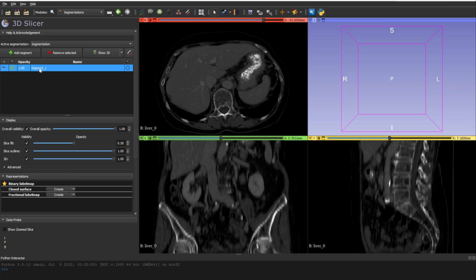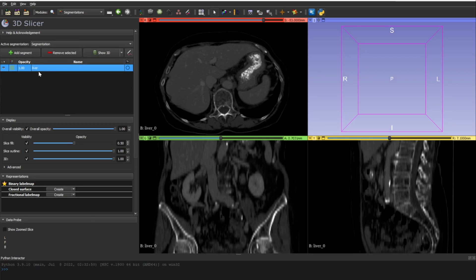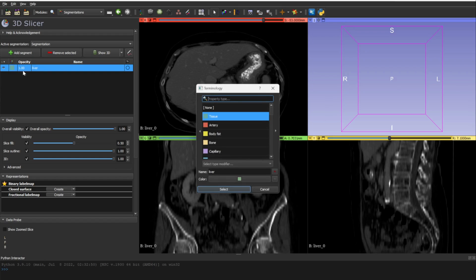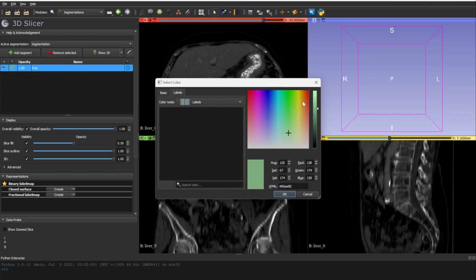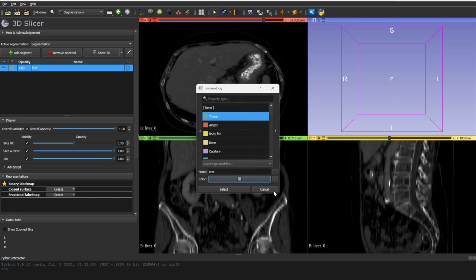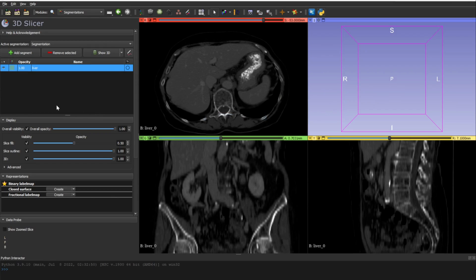Let's create the first segment. Since we want to segment the liver, let's call it 'liver' so you don't get confused if we have other classes. If you want to change the color, click on it twice and search for the color you want, or pick directly from the palette. I'll leave it green by default.